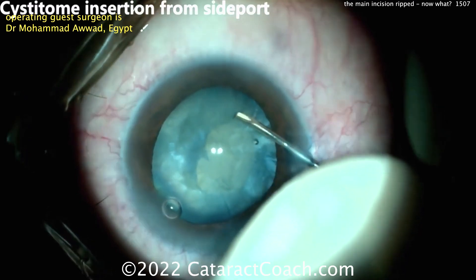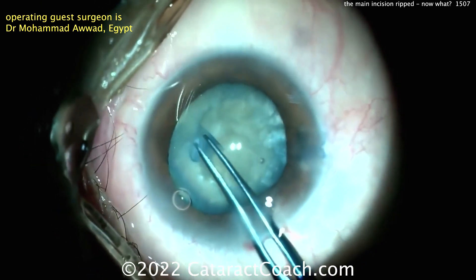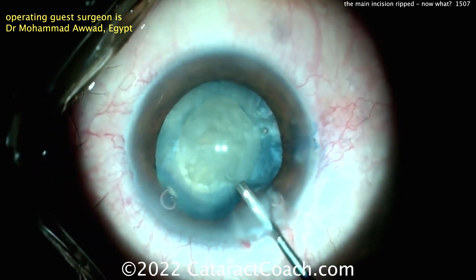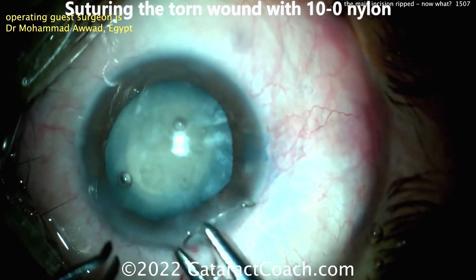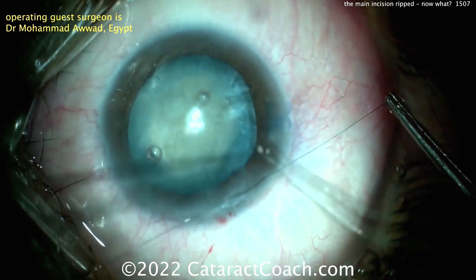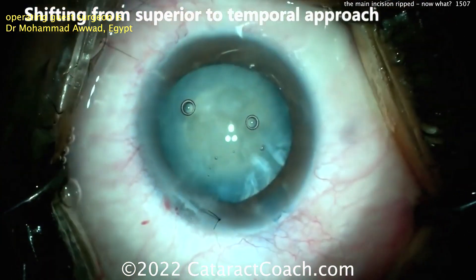A cystitome is probably a better choice. Now that's being done through the side port, and the cystitome can be used to start that tear. The forceps can be used to complete it. But now what do you do? That MVR blade inadvertently ripped or tore that phaco incision. Do you still use it? You've got to be really cautious because it's going to upset all the fluidics of the eye. The better part of judgment is to avoid using that incision. So suturing it up here — 10-0 nylon being used to suture that incision and repair that laceration. Just be warned, it may need more than just one mattress suture. You may need to put a couple of radial sutures in too.